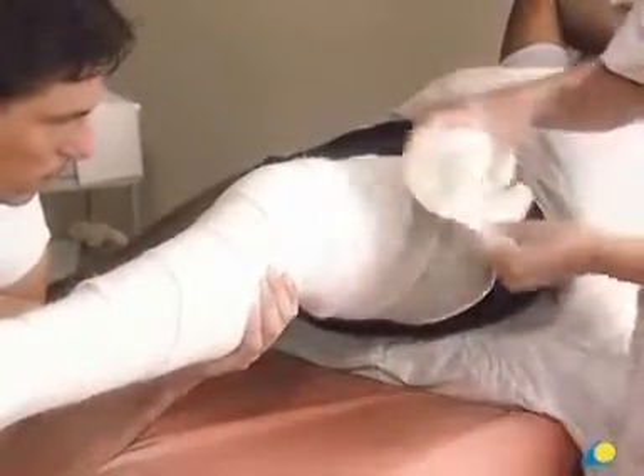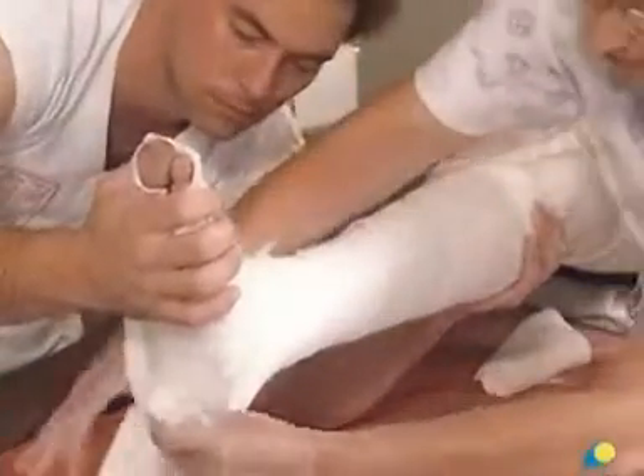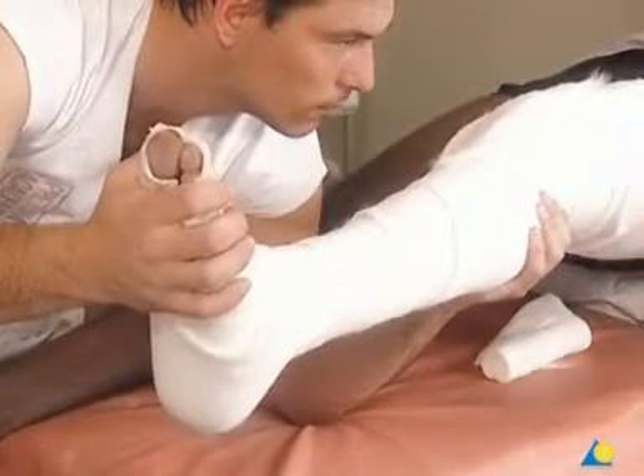The cotton wool extends slightly beyond the planned length of the cast, so that when the end of the stockinette is folded down, the end of the cast will be padded. Additional cotton wool padding is applied to the patella, the malleoli, and over the heel to protect against pressure points causing pressure sores. It should be kept in mind that when more padding is applied, there will be less support to the injury site.